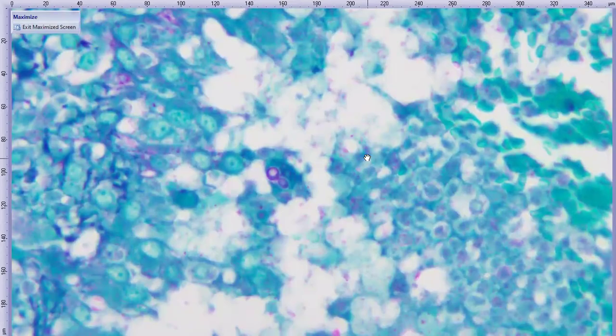And you may have had a specific type of fungus in mind based on the morphology of having hyphae, pseudohyphae, and yeast types all in the same place, which is Candida. So Candida organisms are the ones that tend to do that. That would be a pretty unusual diagnosis to make for an endophthalmitis, though. And it can be difficult to definitively speciate a fungus based on histomorphology alone. But we assume that this is the same fungus, and at least Candida is our top suspicion, despite it being a rare cause of endophthalmitis.